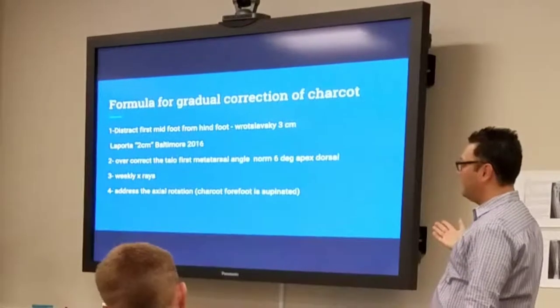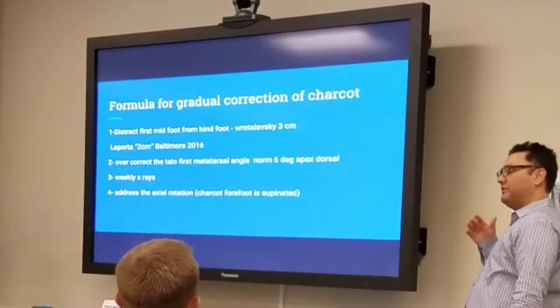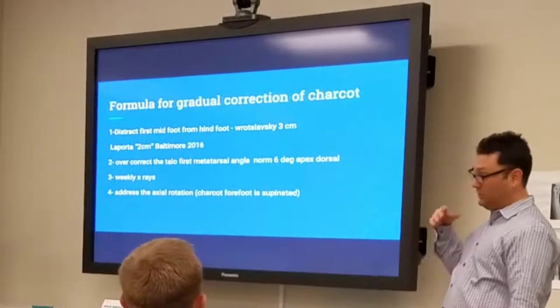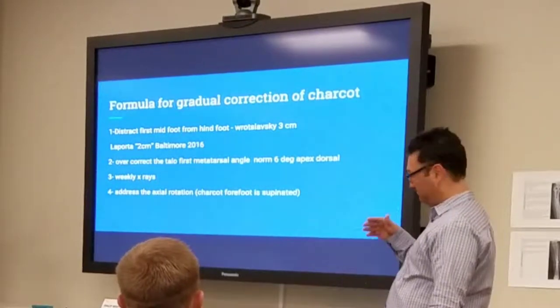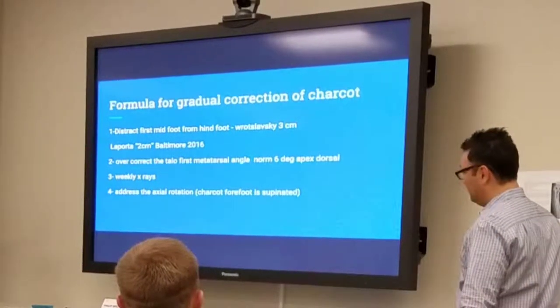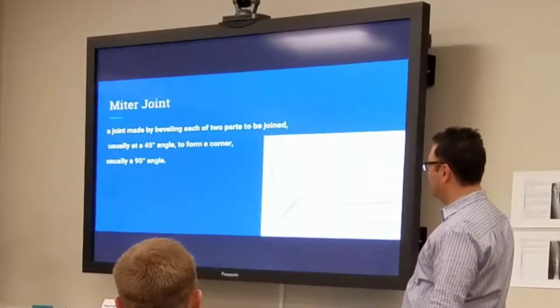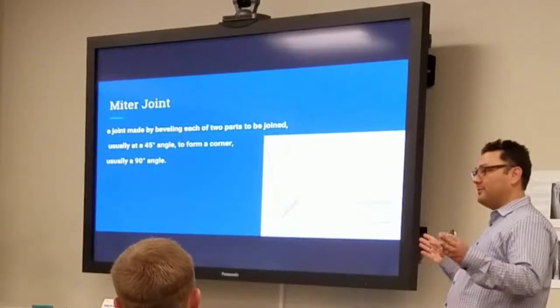You've got to overcorrect that talar first metatarsal angle. So if they're telling you, like, 37 degrees on the calcaneal declination, you want to go a little bit extra. Or if you're using your first metatarsal angle, you want to overcorrect on that. I do weekly X-rays. Always look for the axial rotation. So now for the actual frames. What is this miter frame that we're talking about?